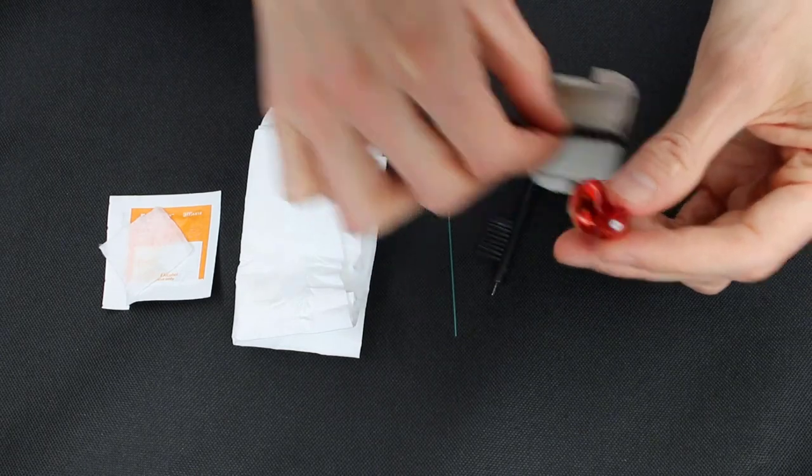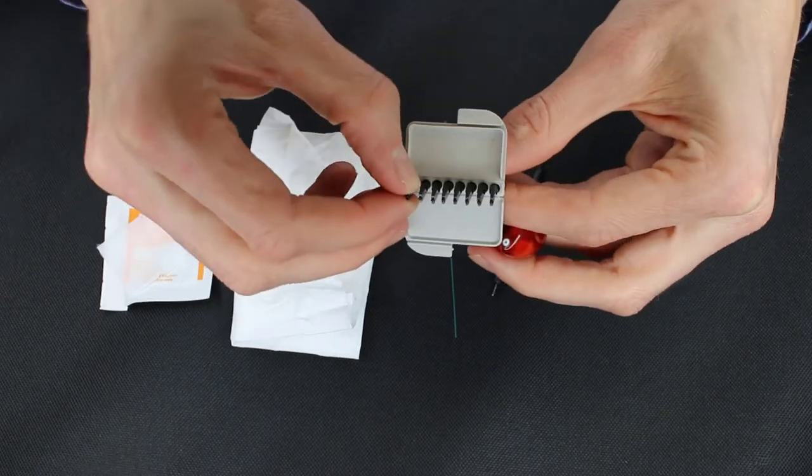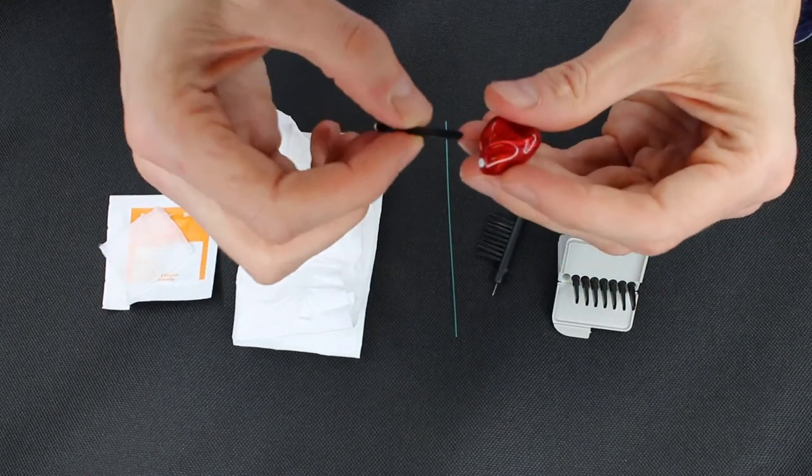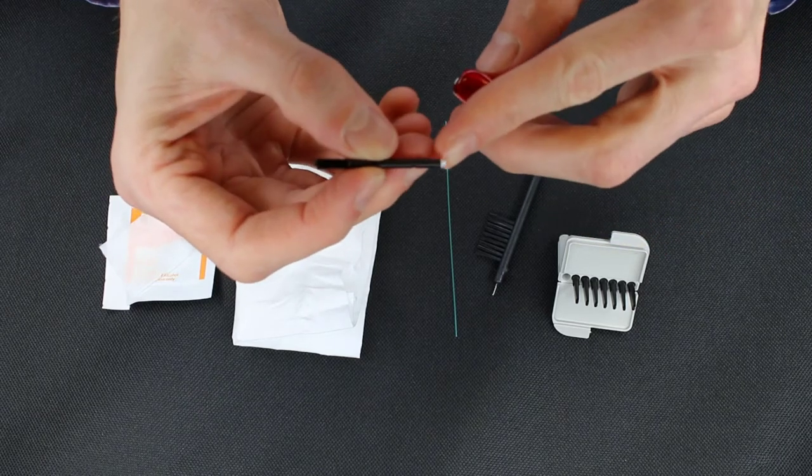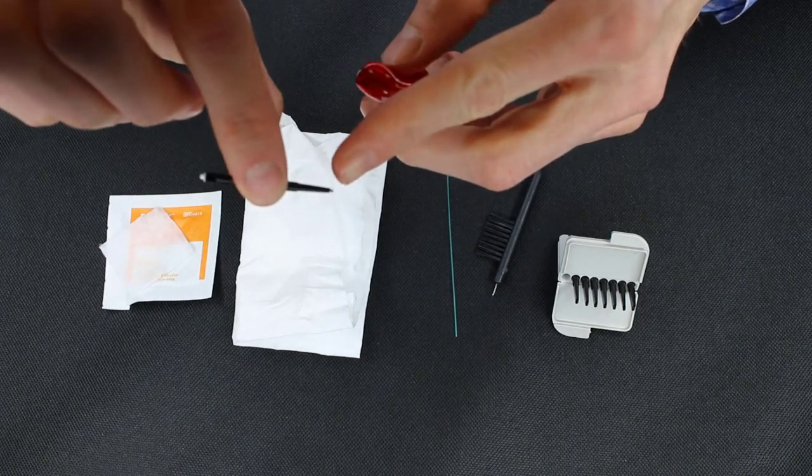So this little kit that we have here is a bunch of wax trap exchangers. And so how this works is we have a new end with the new wax trap, and a removal end that we can take out the old one.